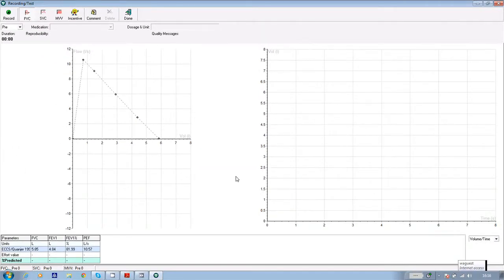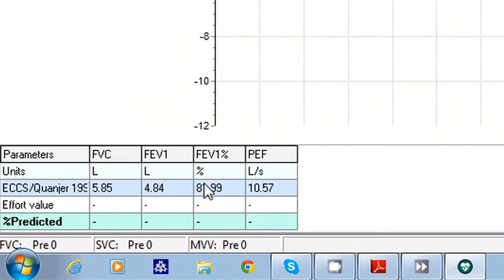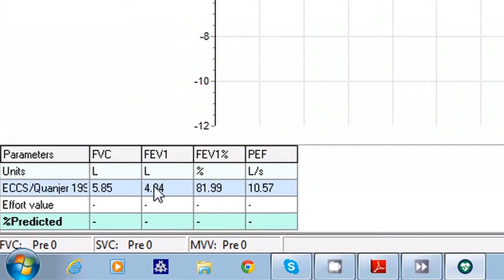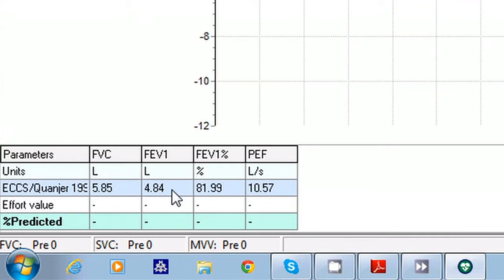The screen changes to show the predictive norms for the patient based on the information you've given the software for FVC, FEV1, the ratio, and PEF or peak flow. But first click on SVC at the top of the screen. This stands for slow vital capacity or relaxed VC, and this is the first test you're going to ask the patient to perform.